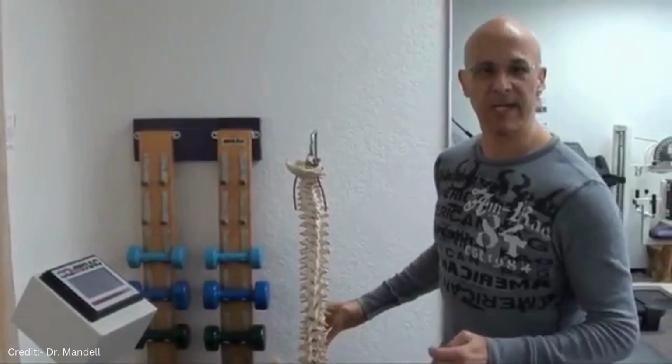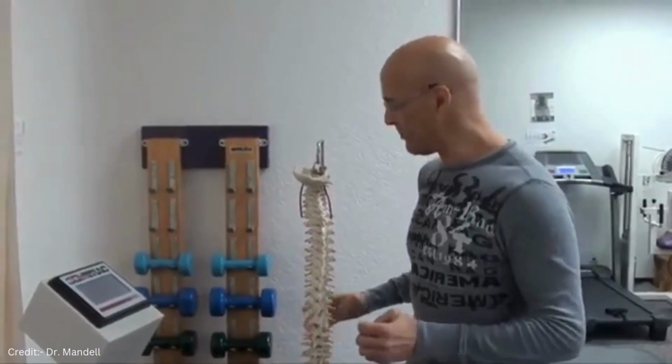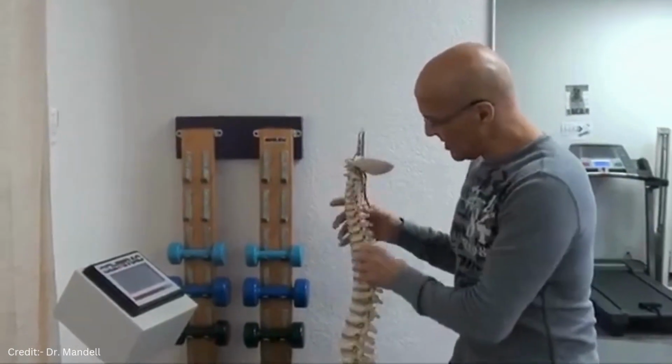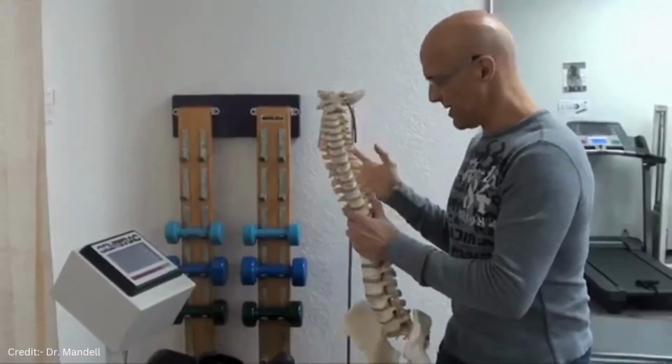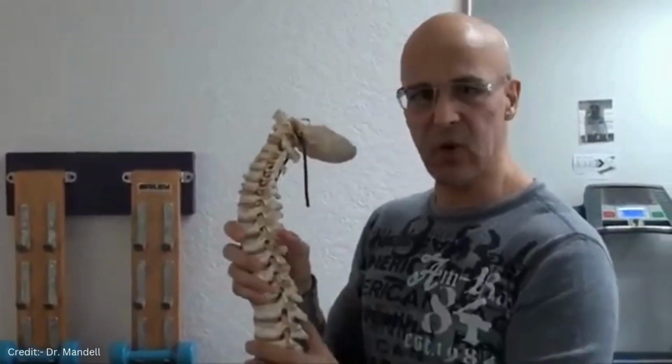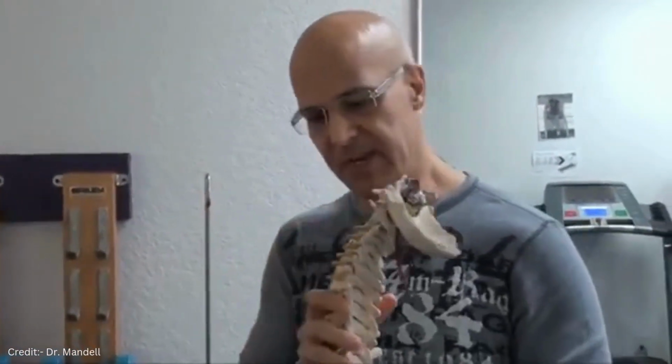I'm Dr. Mandell. I want to talk about decompression therapy. Decompression therapy is decompressing the discs. This is the spine, and we're concerned about the cervical spine. It's supposed to be a C-shaped cervical lordosis in the curve of the neck.